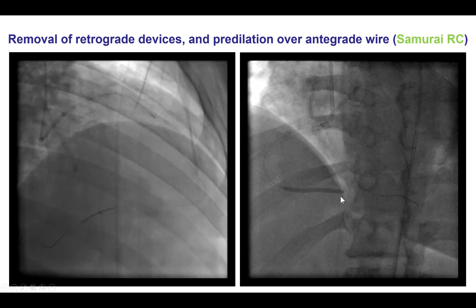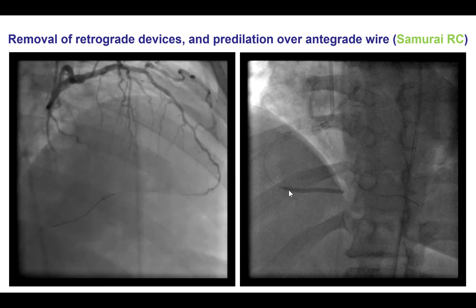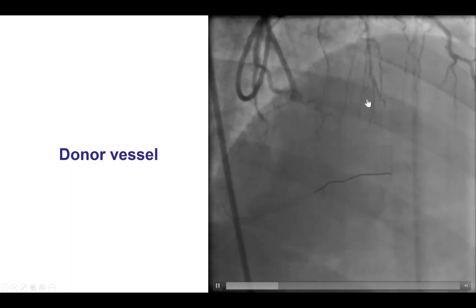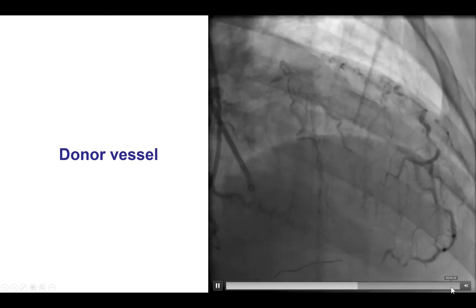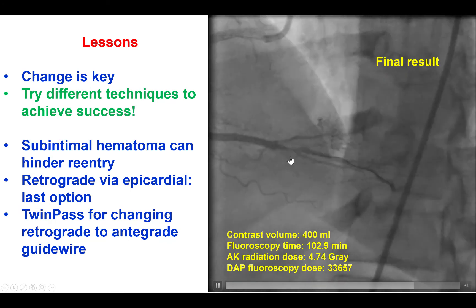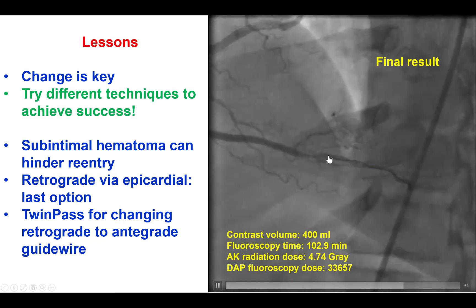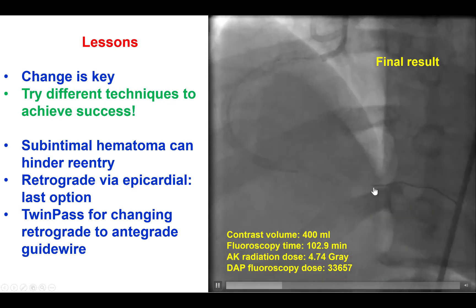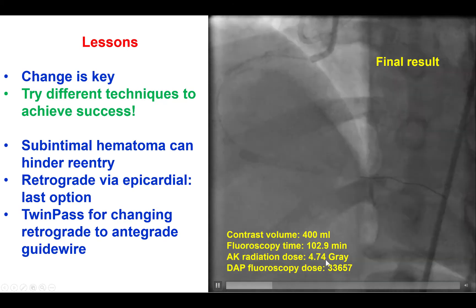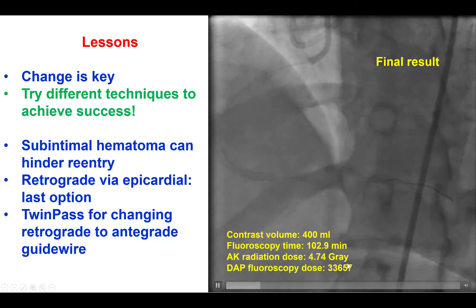We then placed several stents from the distal to the proximal right coronary artery, given the extensive dissection and hematoma in the distal right coronary. We confirmed no injury to the epicardial collateral and achieved a nice result with TIMI flow in the right coronary artery. There was some residual disease in the posterior descending artery, but with excellent flow, we decided not to place further stents. About 400 cc of contrast were used, with close to 5 gray radiation dose and long fluoroscopy time, reflecting the complexity of the case — though we stayed under 5 gray overall.